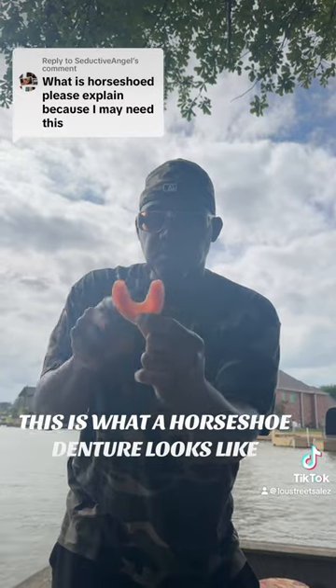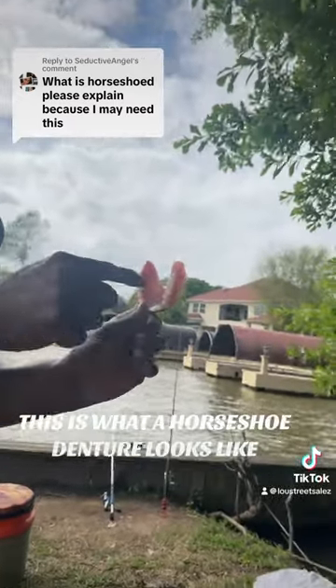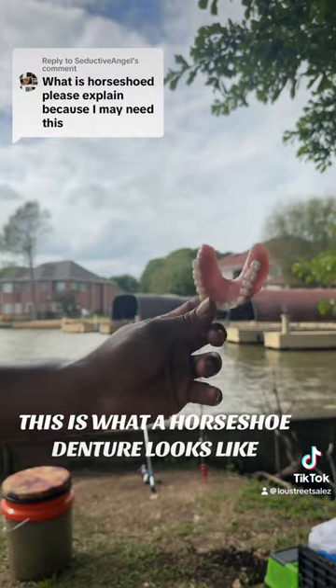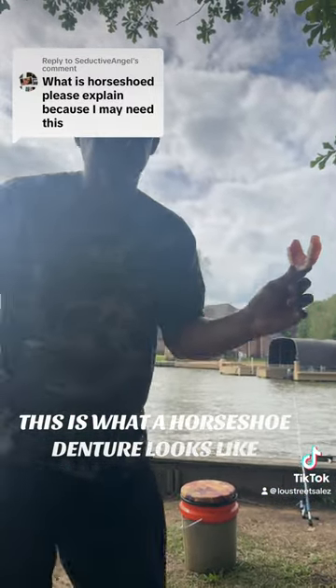Do you still have suction with it? You have suction — the suction is at the top right here, up in there. So make sure they don't horseshoe it too much. You can't horseshoe it too much — just like that, you have a little suction.